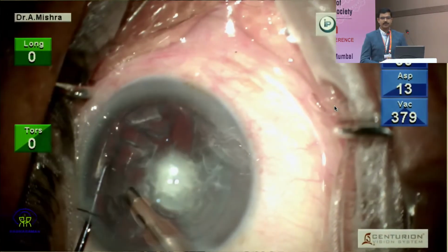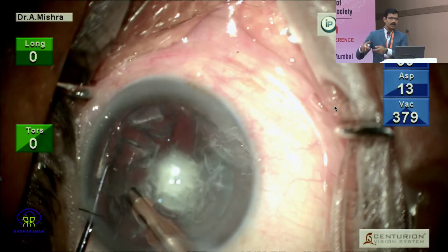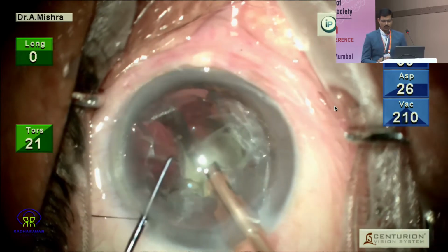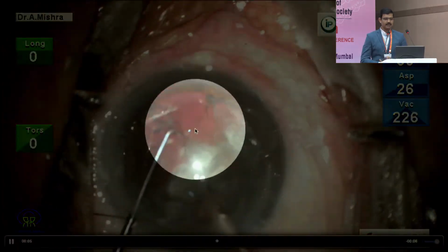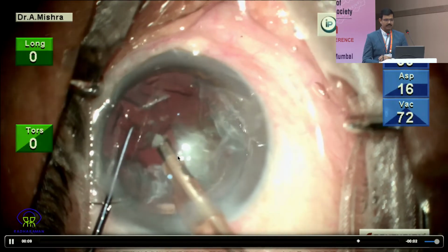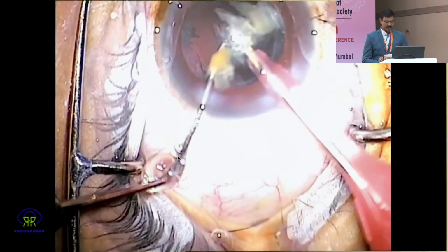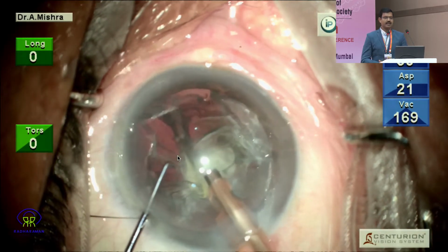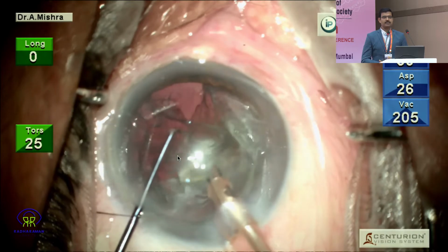The third is, of course, apart from seeing a rupture happening in the posterior capsule, if you notice, there's a posterior polar cataract, as you can see, and we can already see a rupture happening vertically out here. But what I'm going to show you is a small nuclear fragment, and a small nuclear fragment, and look at the way it fibrillates there.